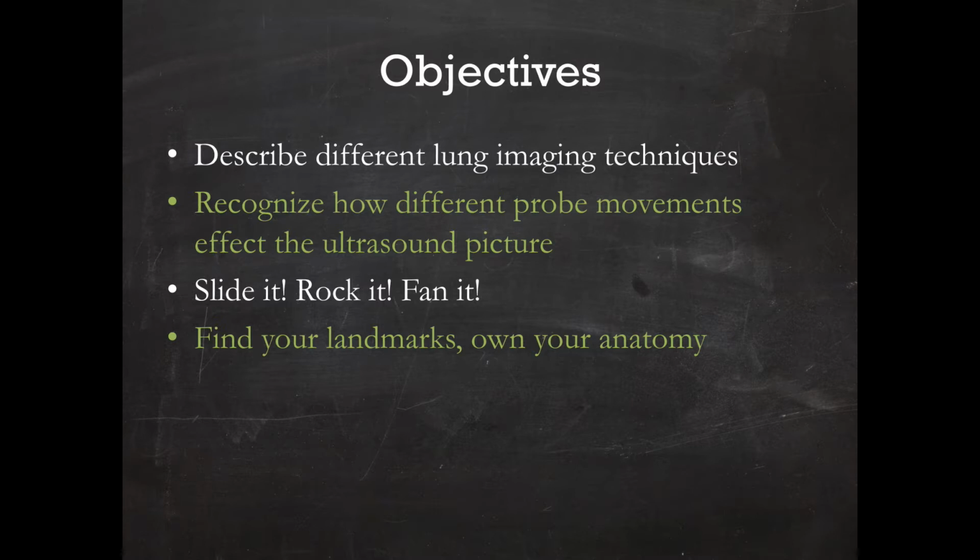the image on your screen, and specifically turn our probe motions into a set of 3 moves: slide it, rock it, fan it. And by the end of this, you're going to know all the major sonographic structures you're looking at and leverage these to troubleshoot your image.